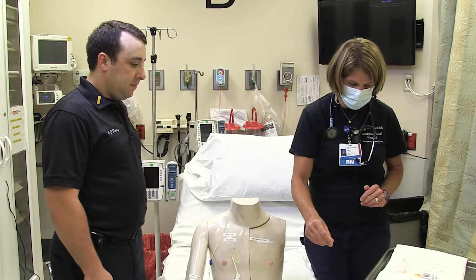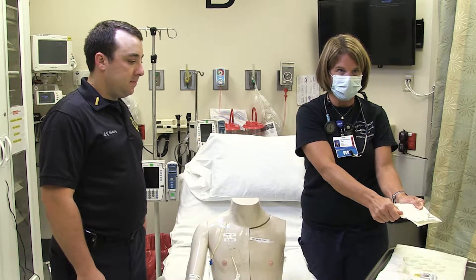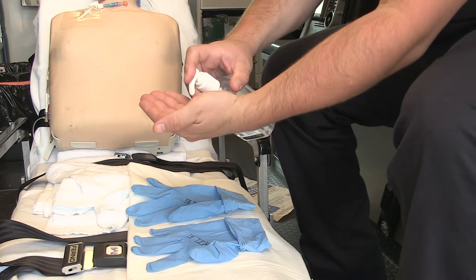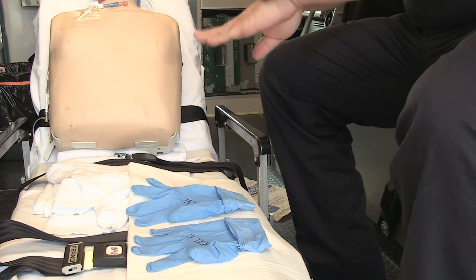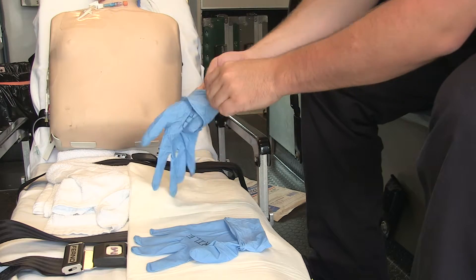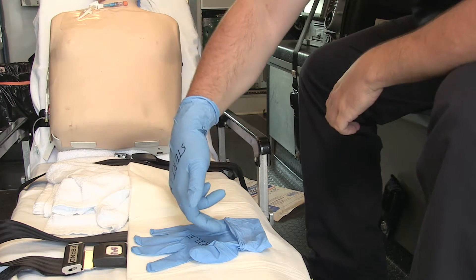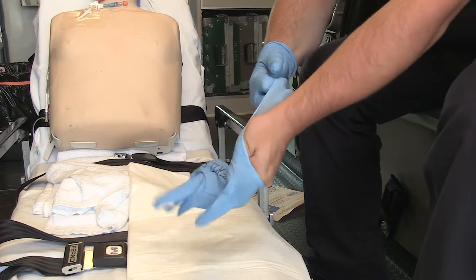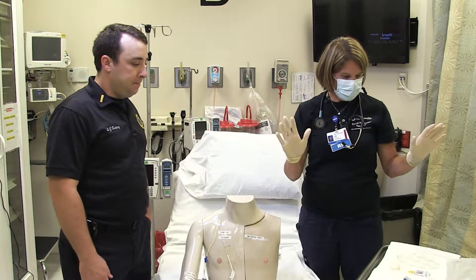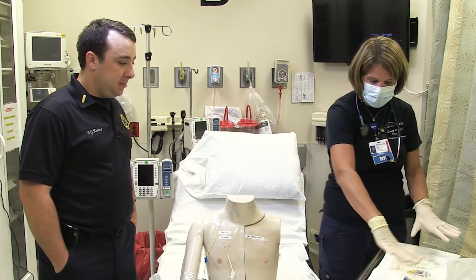At this point, I'm going to go ahead and put on my sterile gloves. You're going to just open it up — you don't want to lay this on your sterile field because then you'll have contaminated it. Anything you touch, you've now contaminated — it's no longer sterile. So pick up your first glove here, put your hand in, slide your glove on — you're touching where it's folded down, cuffed. For picking up your next glove, to keep everything sterile, tuck it under that cuff, pick it up, hand tucked under there, then slide on. Both hands are sterile. Leave the packaging alone — your chances of contaminating it now are likely. Everything I touch here is sterile.